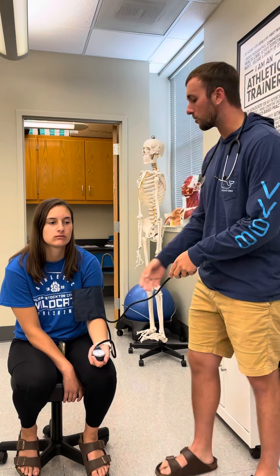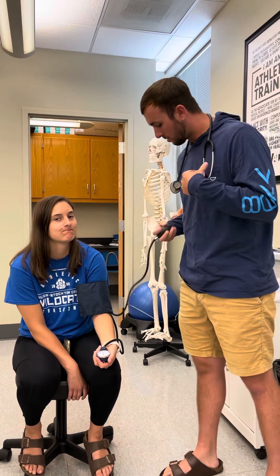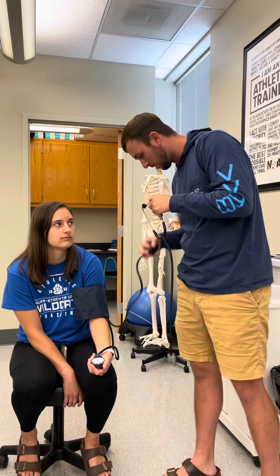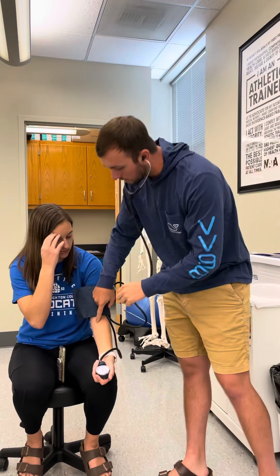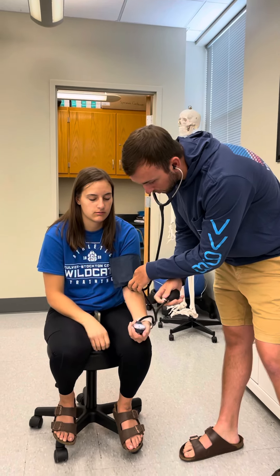For this video we put the cuff around Ellie's left bicep and then put on the stethoscope. I'm going to place this in the pad and then pump to 200.